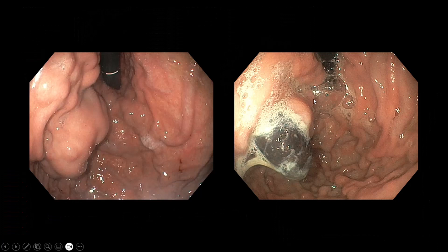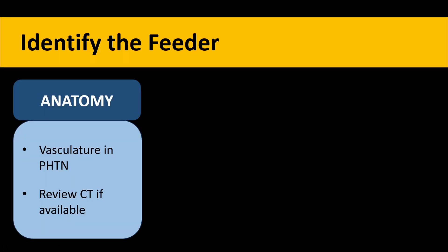On post-procedure endoscopy one month later, this large varix was gone — only a small glue cast remained. This patient was treated a year and a half ago and remains in follow-up. The key is to identify the feeder vessel, which requires knowing the anatomy of the vasculature in portal hypertension and exactly where the collaterals take off.